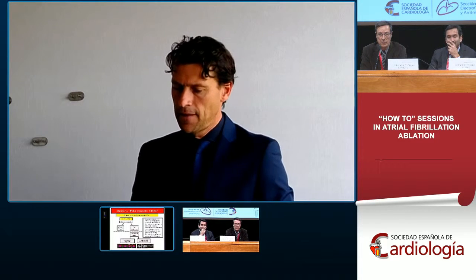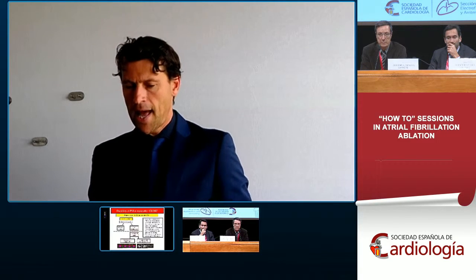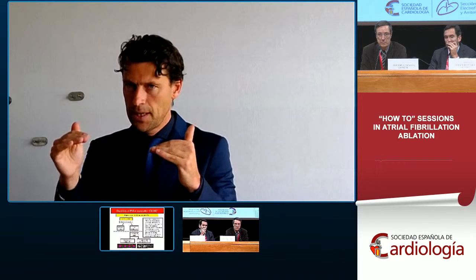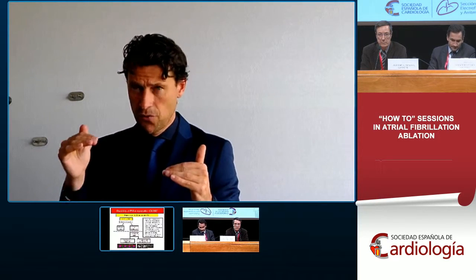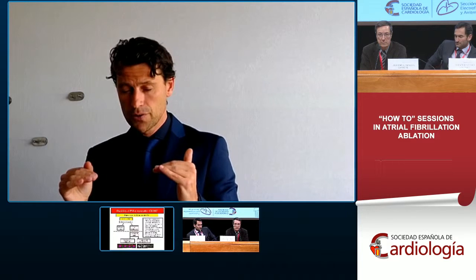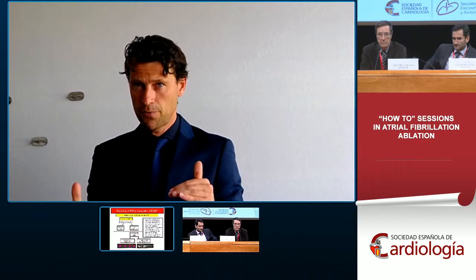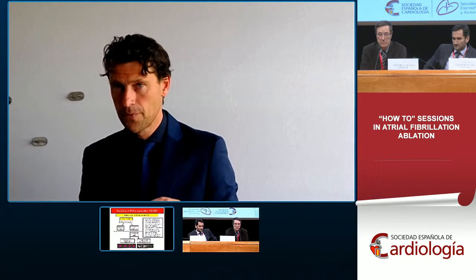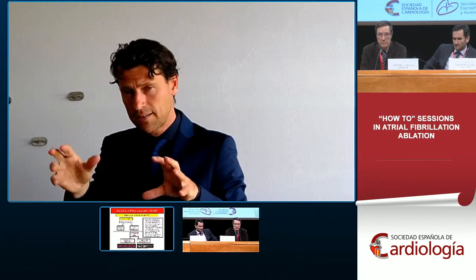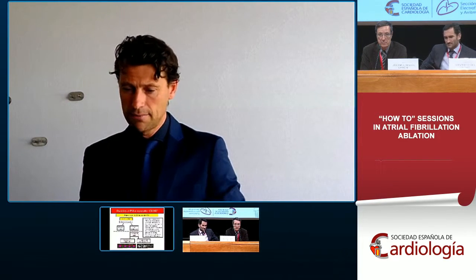Good point, good point. So I will tell you how the setting is in our lab. We use power controlled, and we have a pseudo power control because we look at the temperature. And the moment the technician sees 41 degrees in our lab, we reduce the power. But it's power controlled, so it means that I give the power from the first second. If it's set to 35 watts, you will see 35 watts. That's different from temperature controlled. But it's not completely power controlled because we are still looking at the temperature. I don't like temperatures that exceed 41 degrees, then I'm afraid of steam pop. That is how we have been ablating from the very start.